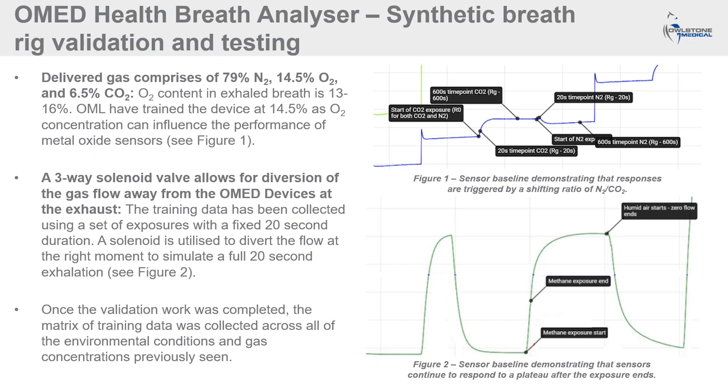This brings me on to my second point. We found that during a 20-second exposure, which is the duration people are asked to give a breath sample into the OMED device, the sensor response will start to climb but continue climbing after the source of gas is removed. Now, this happens because the test gas mixture is still passing through the protective diffusion barrier, and it occurs in a real breath sample as well.